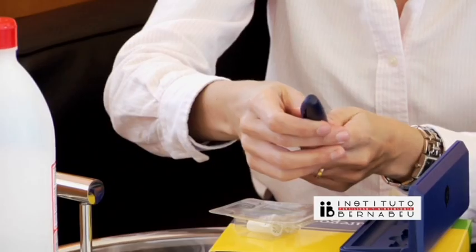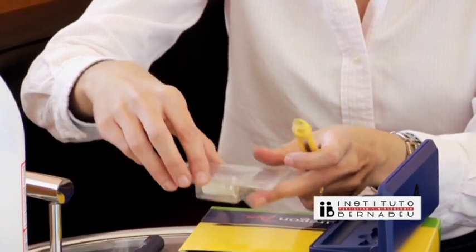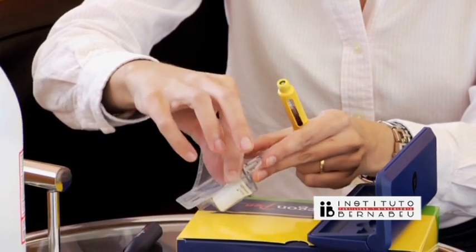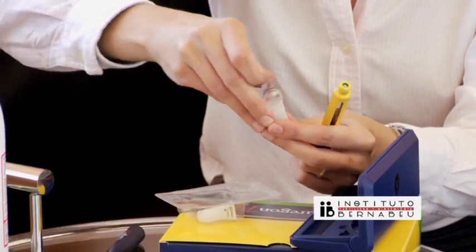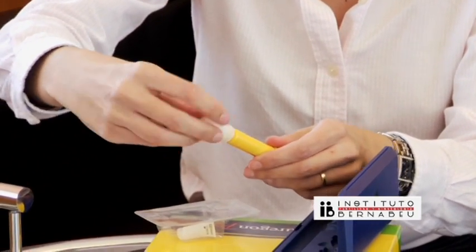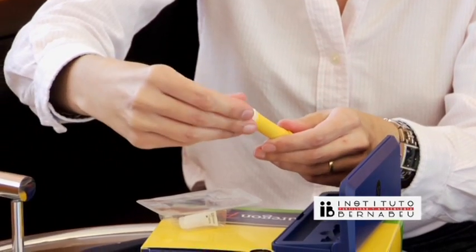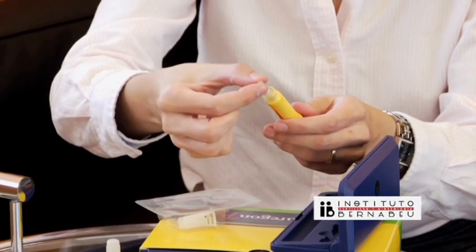The next step is to attach the needle, which is provided with the pen. You have to open the paper seal and screw the needle onto the pen. Then take off the cap and remove the protective sleeve.